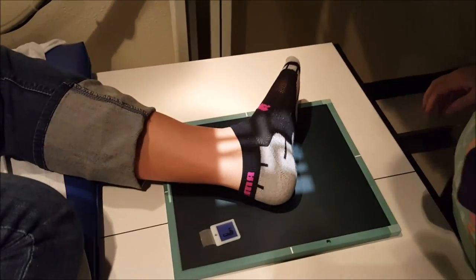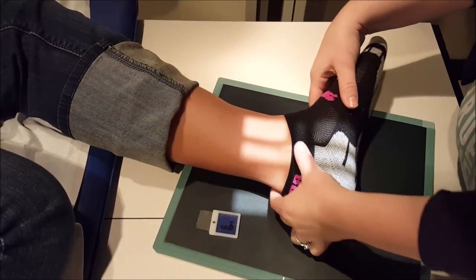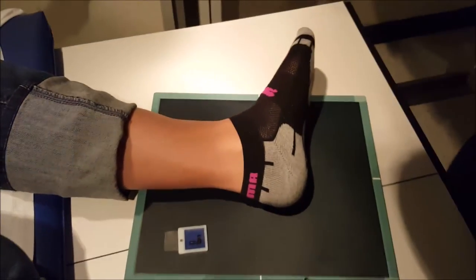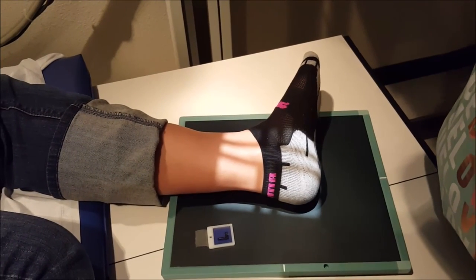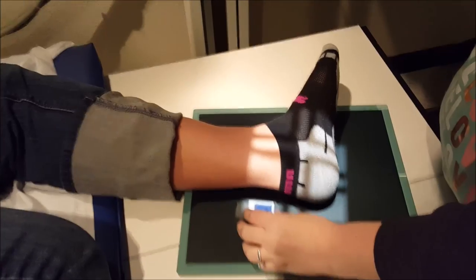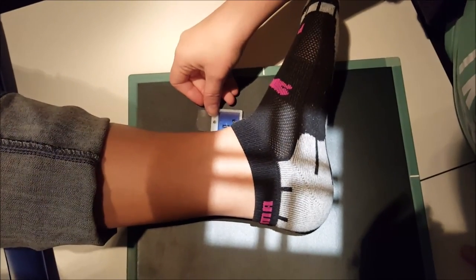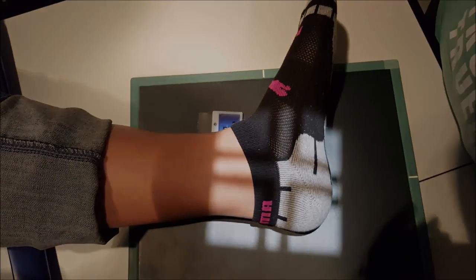For the lateral calcaneus, you're going to have them in the same position as you would for lateral ankle, which is the lateral side against the IR. You're going to be centered an inch distal to the medial malleolus. There is a little tiny bit of light up on the lateral side, so if you can, I would rather put the marker on the lateral side than the medial side of the patient.